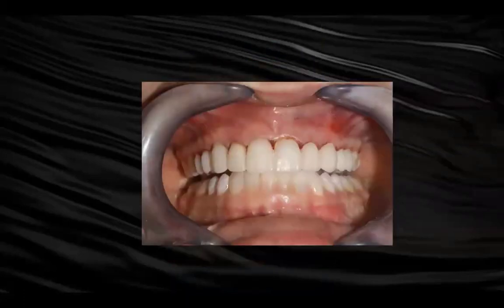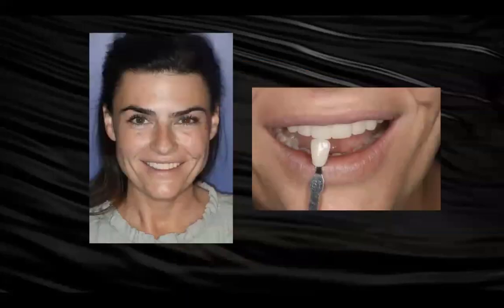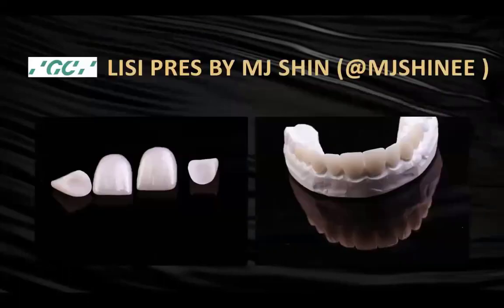So there we are, immediate post-op. Kelly is very, very happy. She's seeing a much bigger smile, and she's moving up the corporate ladder. So she's really excited about how natural it looks. She didn't want something that's jacked up at all. She was looking for more of a B1 shade, and I love the B1 shades a lot. It gives me a chance to create beautiful, natural smiles. I think that when we get into the bleaching stuff, it's nice, but sometimes it's a bit obsessive.